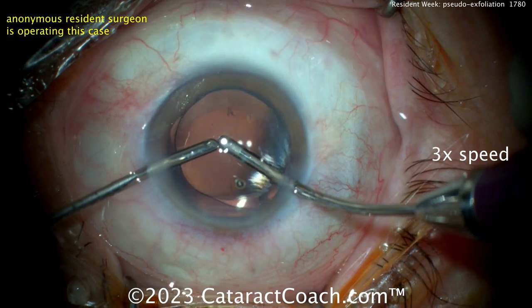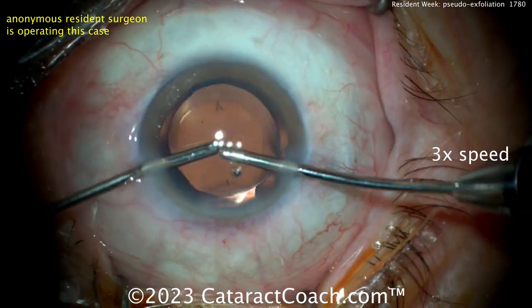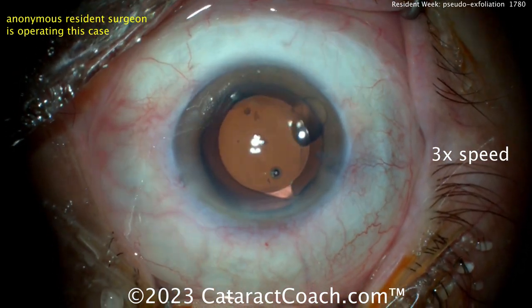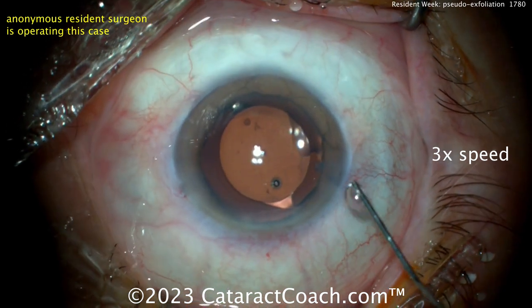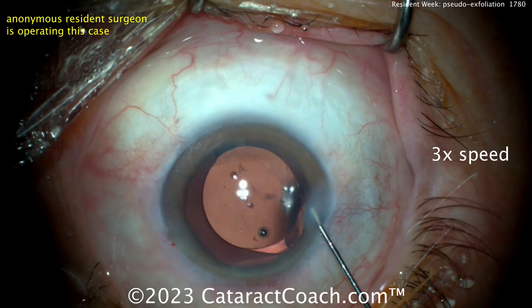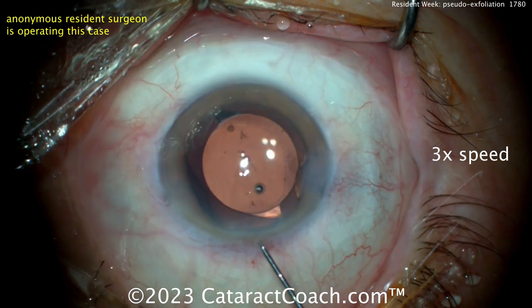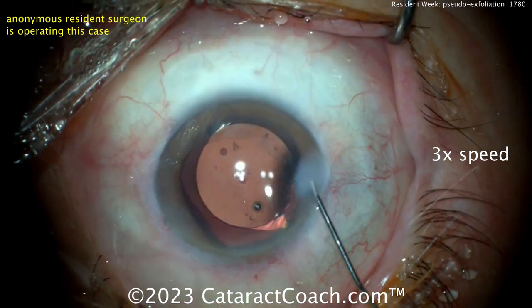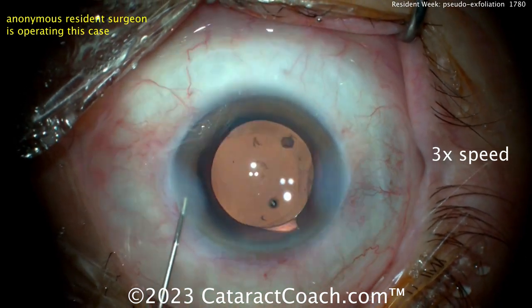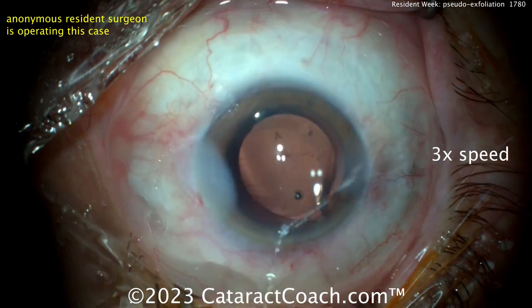Cleaning up, looking good. Beautiful overlap of the optic by that rhexis — good job, young resident. You are doing a fantastic job here; I'm glad you sent the video in. Let's see how you finish up. Is there a little piece of nucleus there? A little chunk? Yeah — hopefully we'll get that out of there. Don't leave that in there. Just tap the main incision and it'll come out. Keep up the good work, good learning, good progress. Stay tuned this week for even more great videos from Resident Week.